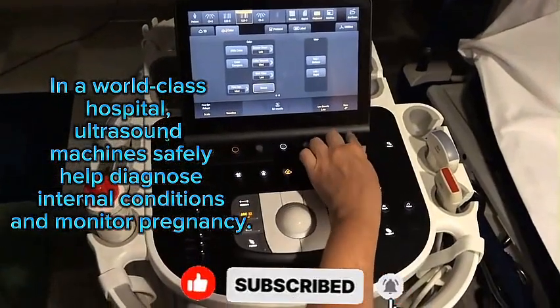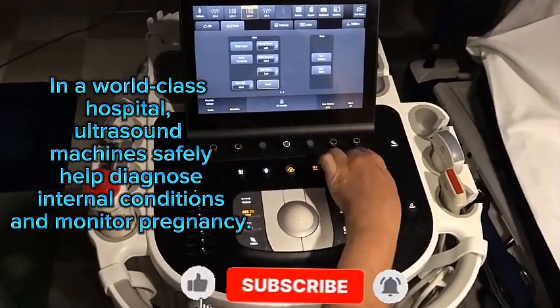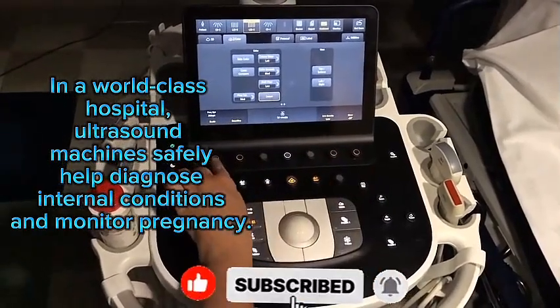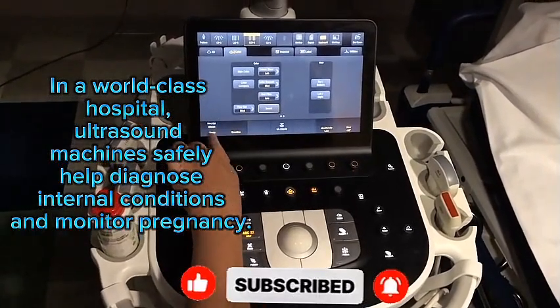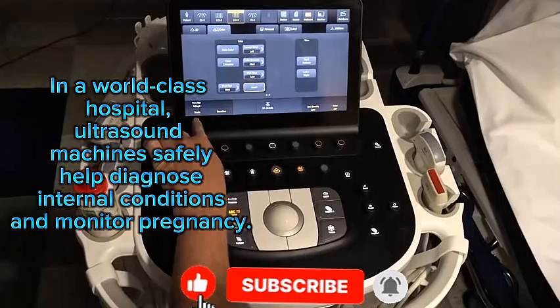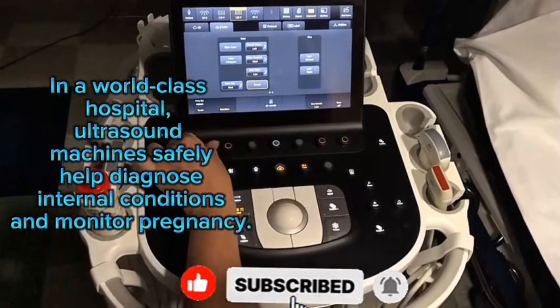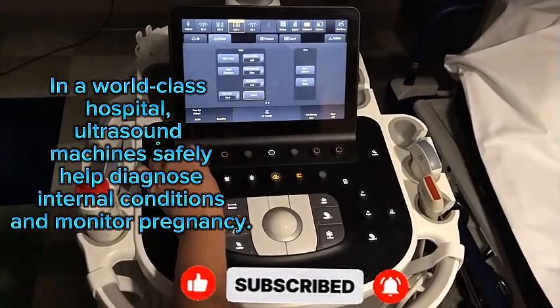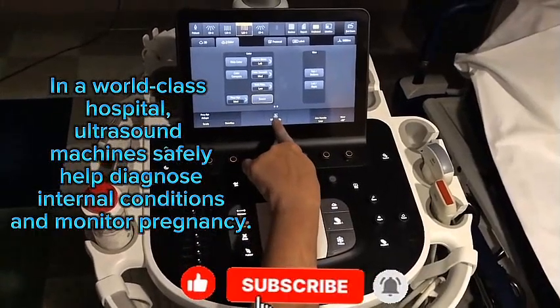To steer your color box, this is the knob that you will use. Here it says steer, and that's in reference to this knob and what this knob's function is at this point in time. And the scale to the color is this knob at this time, and this screen is telling you what that knob will do. So this is the scale that is set here. And you can decrease your scale by going counterclockwise or increase your scale if you're in a high flow situation by going clockwise.